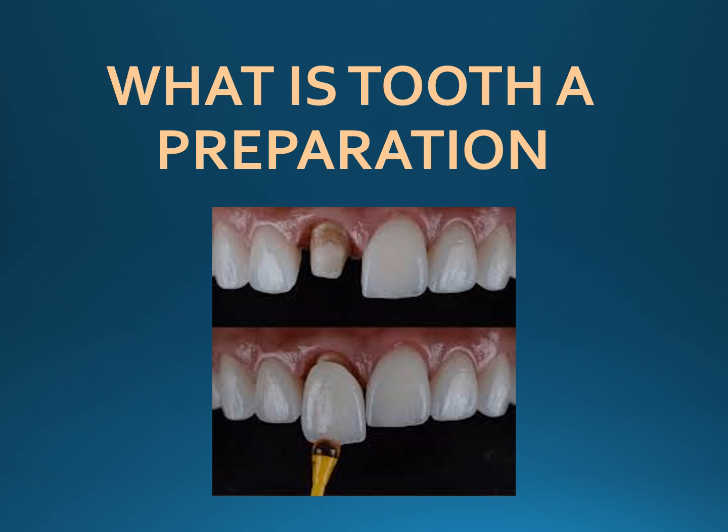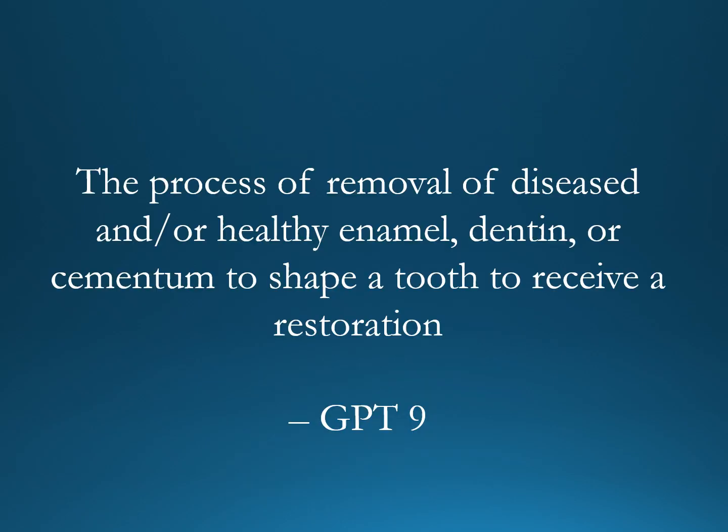After endodontic treatment or a tooth fracture, or when we have to replace the color of the teeth or change the shape of the teeth, each tooth has to be prepared to receive a crown. This crown is a dental restoration, which is a fixed restoration. So it's a fixed prosthesis. Any preparation which is done to receive a fixed prosthesis on a tooth is called a tooth preparation.